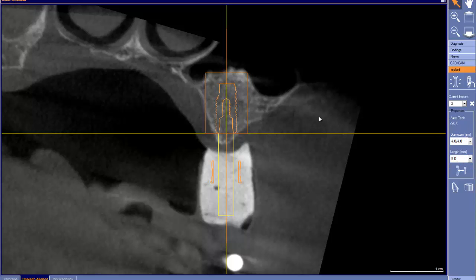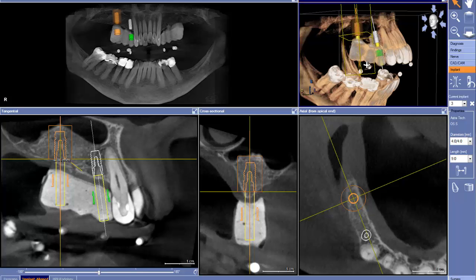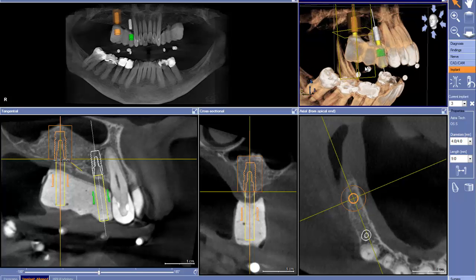So I can understand why we would have chosen to go with the 4mm implant here with this particular brand of implant. The next thing that we're going to look at are two things that are occlusal, restoratively based. That would be the occlusal plane and the occlusal table. And these to me are the most important things that we have to look at, because our goal with implants is to create a long axis support.